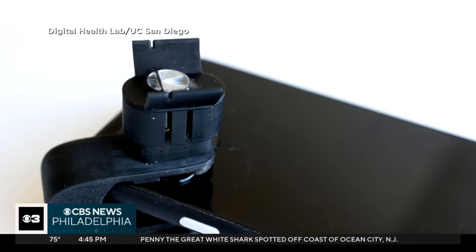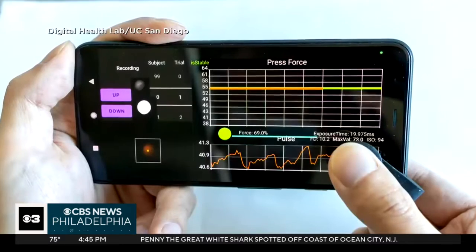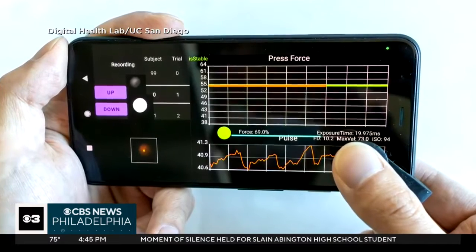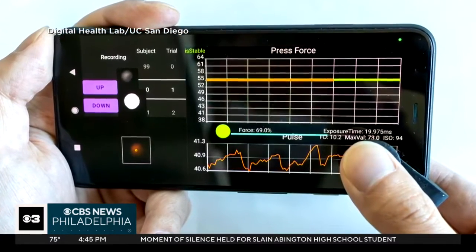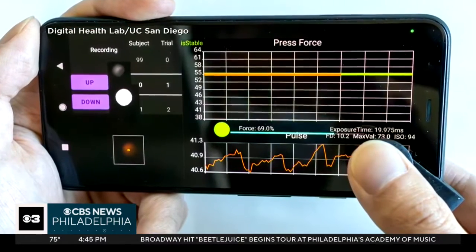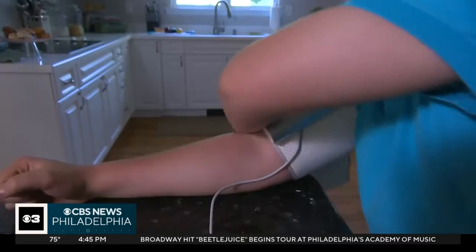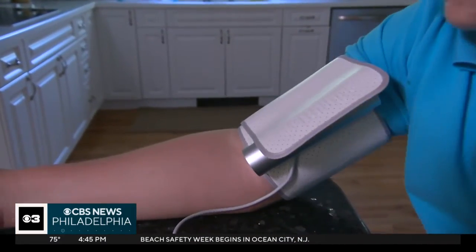The attachment gets clipped over the smartphone's camera lens and flash. The user then presses a fingertip down on the clip while the custom phone app guides you to take multiple readings using different amounts of force. The gadget costs about 80 cents. There are other smartphone blood pressure monitoring devices, but most of those need to be calibrated using an arm cuff as a reference.